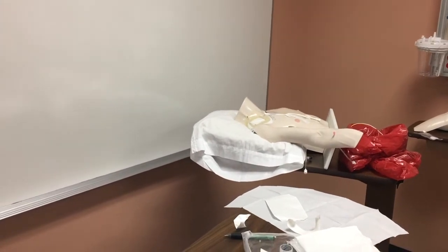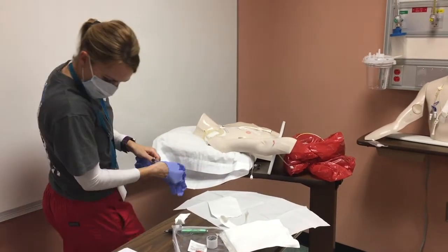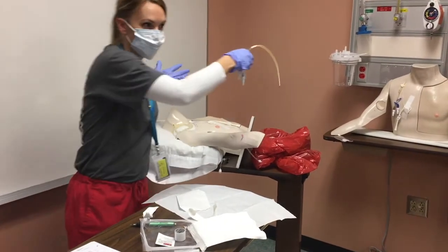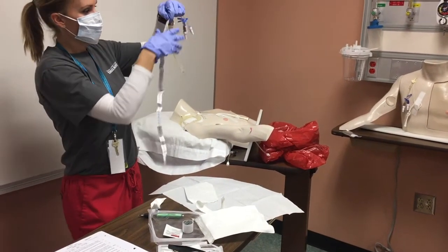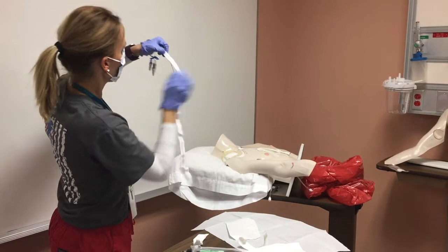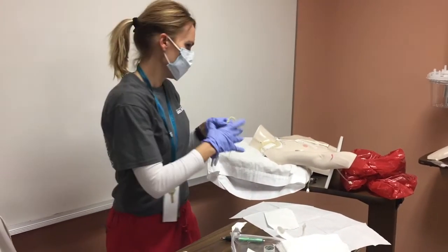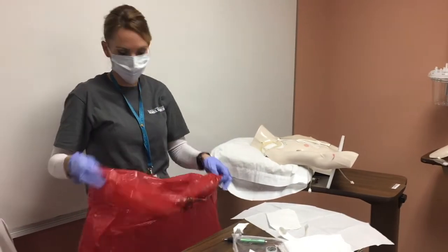I would take a pair of gloves because I would not touch that with bare hands. Put some gloves back on, then you measure the complete catheter — grab it back out of the bag. You measure from the flexible part all the way out. I would say it is 21.5 centimeters. You're going to document that as well, and then you would dispose of the biohazard bags in the appropriate place at the hospital.